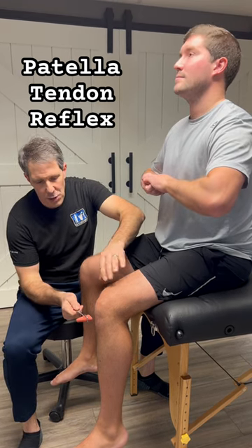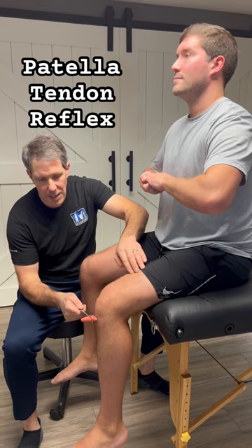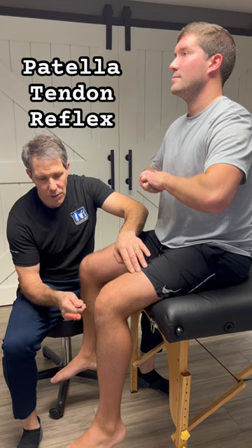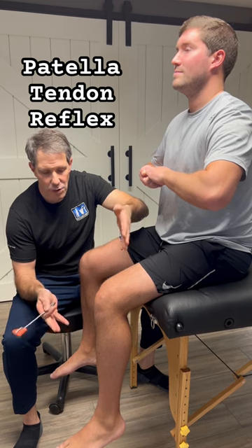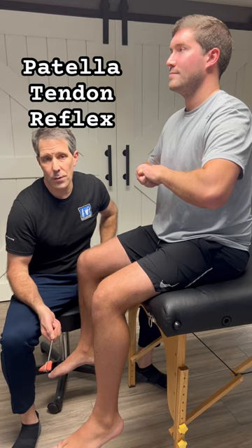What we need to do is make sure that the reflex hammer head is perpendicular to the patella tendon, and then it's just a real quick strike on the patella tendon. That hammer needs to be able to bounce back. That is a normal 2-plus patella tendon reflex for an L4 nerve root.